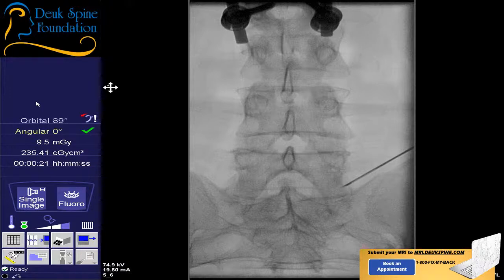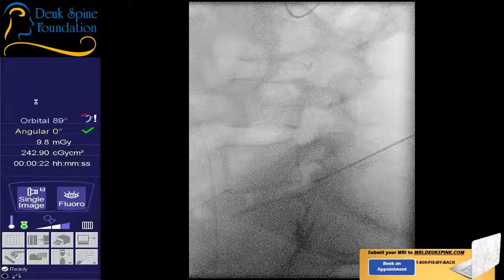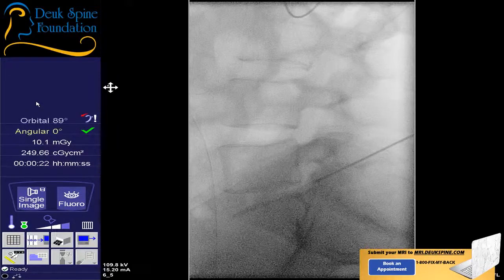Look at her SI joints on that view. It's pretty impressive. She has some swelling in the joints, like an effusion. You can actually see it, which we're treating next. You're fine. Shot.